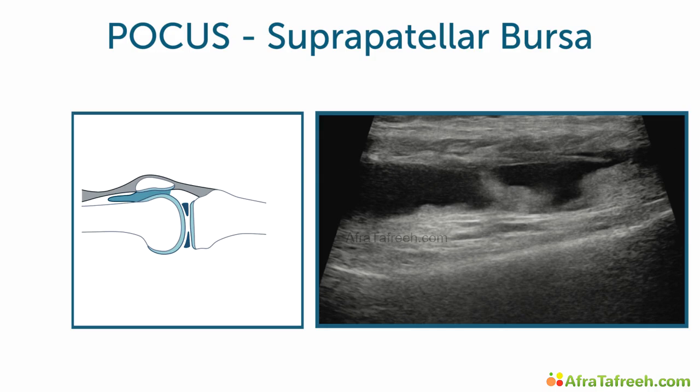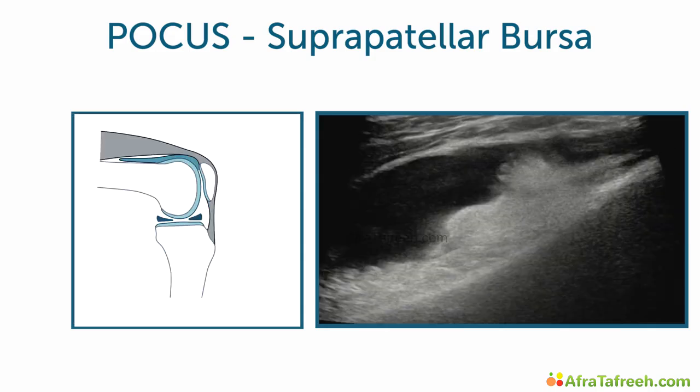Plus, as we see on the next slide, the knee is now flexed at an angle between 45 and 90 degrees. This shows the maximum extent of the fluid in that bursal region. And here on the left, you can see the corresponding diagram of the knee flexion.